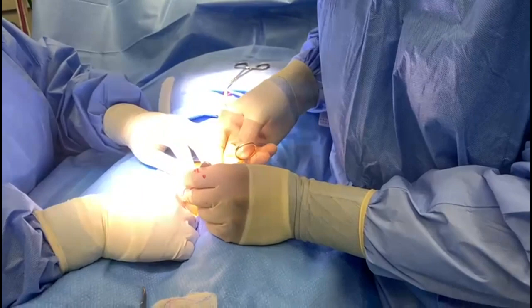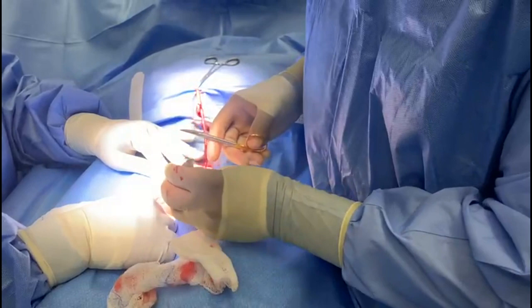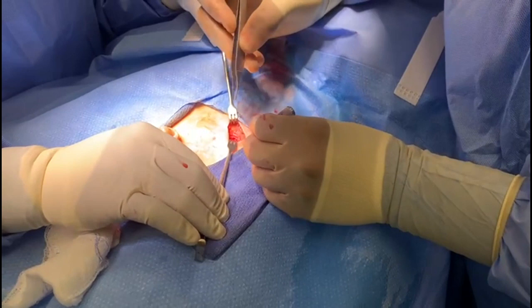We've created our subdartos pouch. In general, when I do hernias I perform orchiopexy at the same time, so we never have to worry about a future torsion in this particular patient. We'll bring the testicle down, secure it just like we normally do, and then close up the inguinal incision.